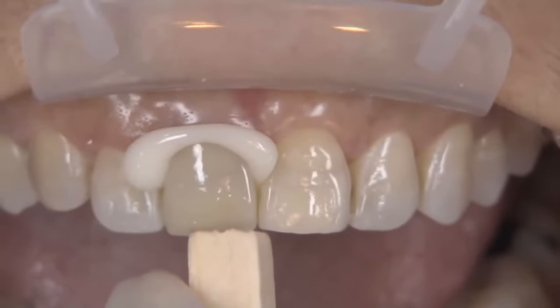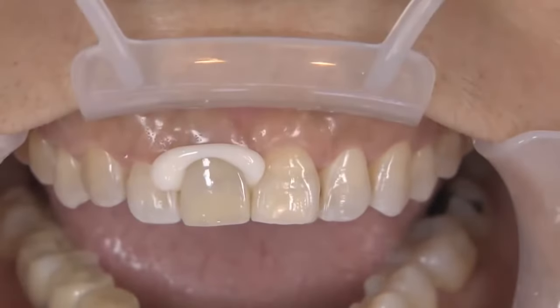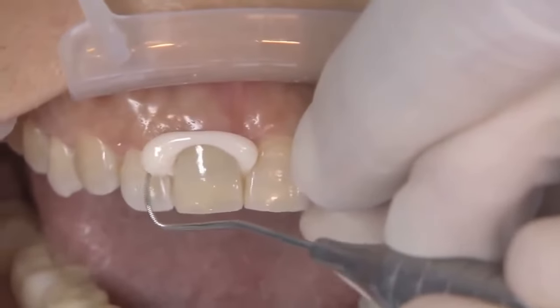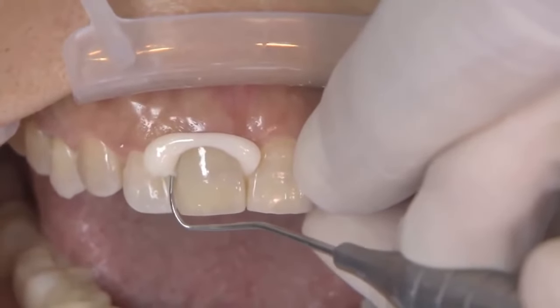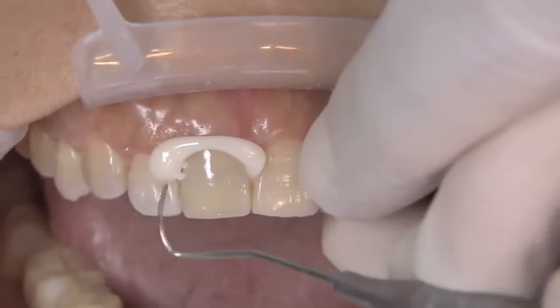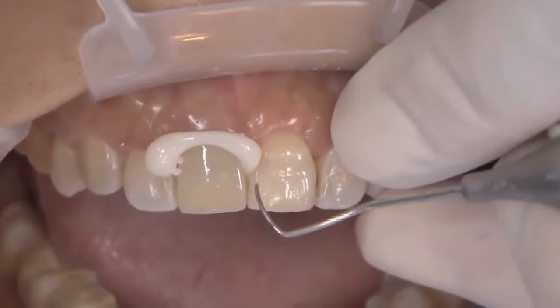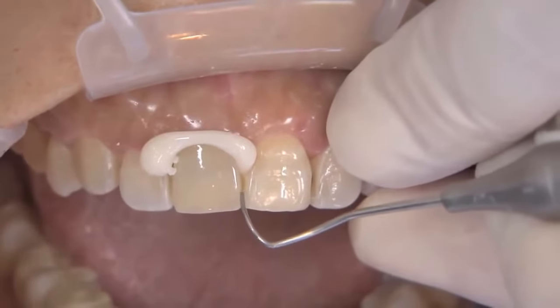One of the neat things about the Nexus RMGI is the light activation. You'll see me hit it and test it with an explorer, and then hit it again for just a second. I'm just trying to get it to its gel state, because one of the unique properties of Nexus RMGI is your ability to take it off basically in one piece — kind of a one-peel approach that I like to take.